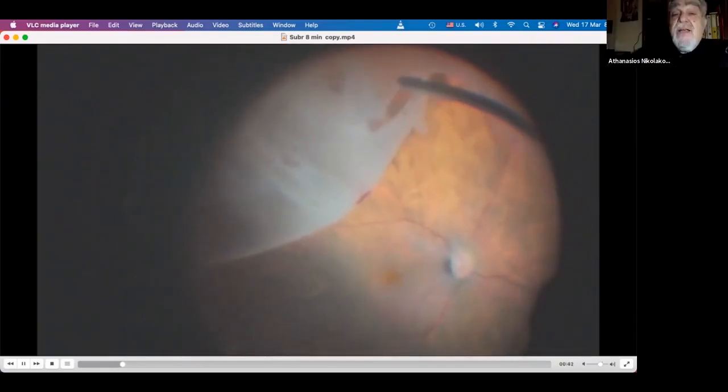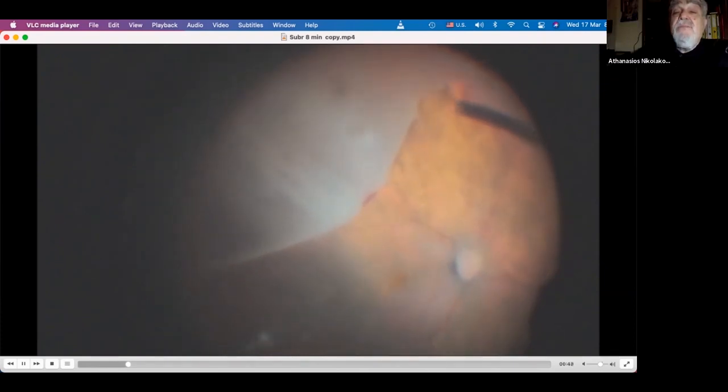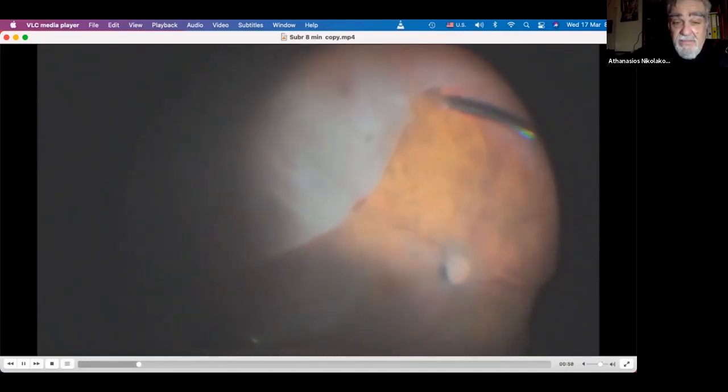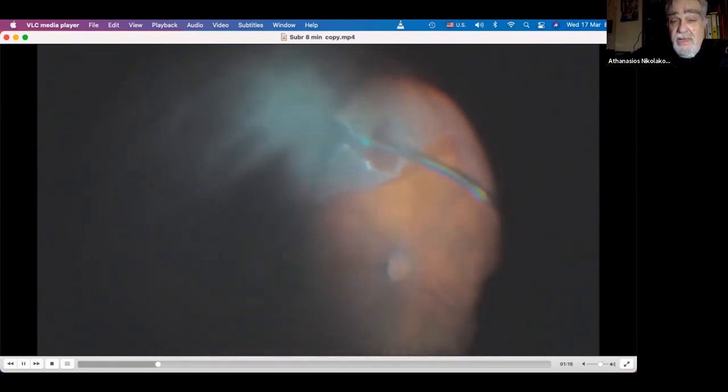Yeah, you are experienced to that. Here we found the tear that it was making by pulling and pushing. And the funny thing is that it was big enough, and we had a glimpse that something was there, but the lens was not at the tear side. This is temporal, this is the lens. We have to suck it out with the fluid needle with the long and try to make active aspiration. And you can see the birth of a nucleus.